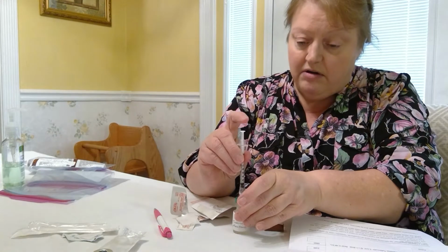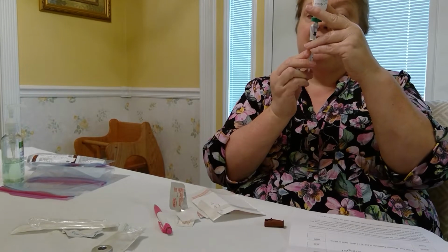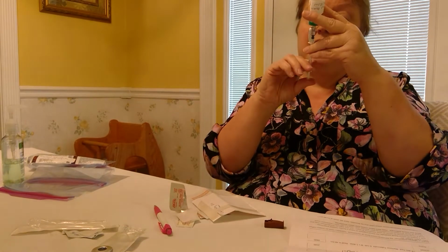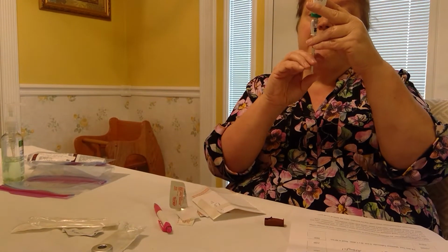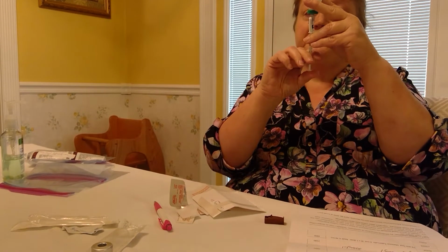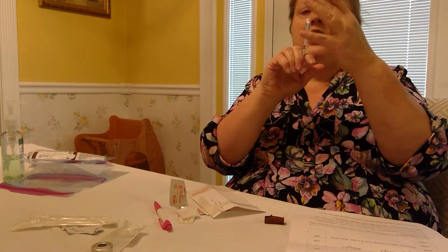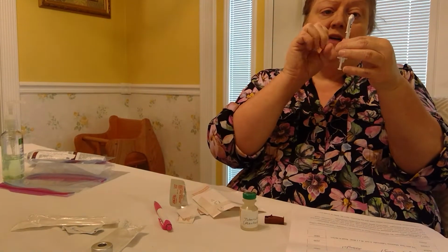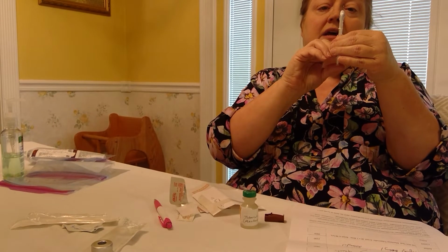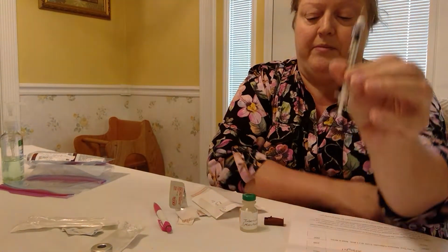Inject air. Turn it upside down. Pull back to the amount that you need. If there's any air bubbles, flick them to the top very gently so that you don't bend your needle. Pull back more than you need if there's an air bubble now at the top. And as you inject back into the bottle, that should go away. If it does not, you can take your bottle off. Still have a little bit of an air bubble. Flick it to the top now that you have the bottle off and go to the exact amount that you need, the 0.1 with no air bubble.